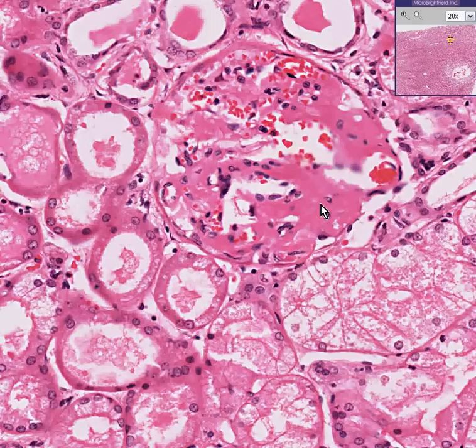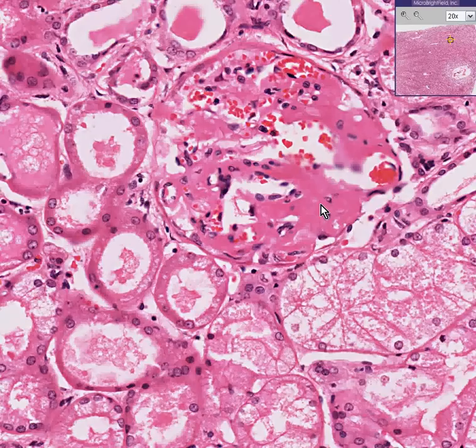As you know by now, the differential diagnosis of pink smudgy material in tissue pathology is a mile wide. Could it be fibrin? Could it be fibrous tissue? Could it be inspissated protein? It could be a whole wide variety of things.